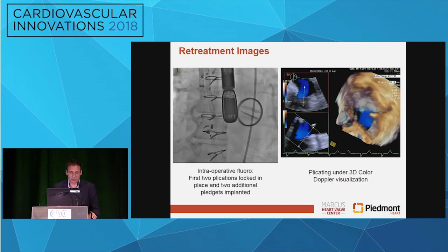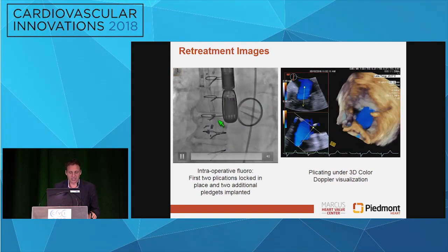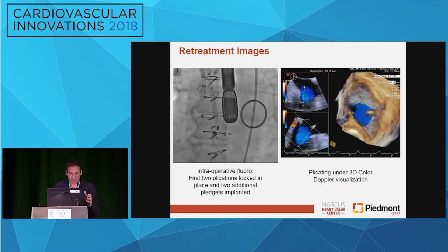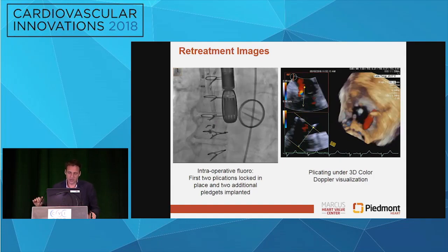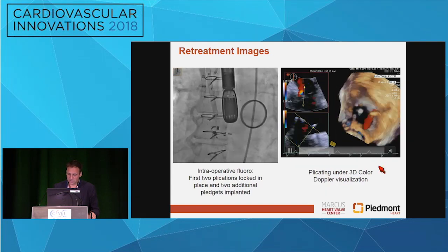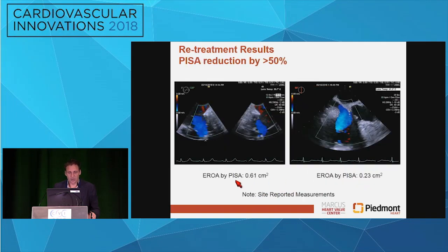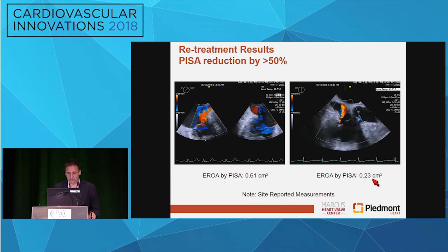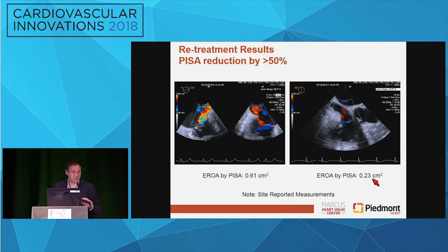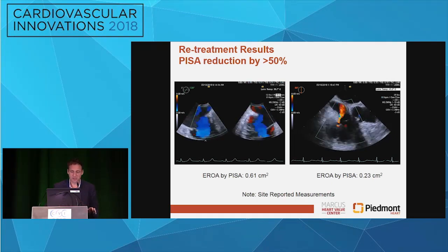Here's a brief image of our retreatment. You can see there are a whole lot of these things now. We did the first two plications around the first one and then did an additional — this is the final plication — a little further up the annulus. You can appreciate just the plicating as you can actually see us closing here under 3D. The color did get significantly better. At the beginning of the procedure she had an EROA of 0.61; afterwards, an EROA of 0.23. She doesn't have her final follow-up images here, but actually now it's even better — she's traced to mild TR now and she feels so much better again.